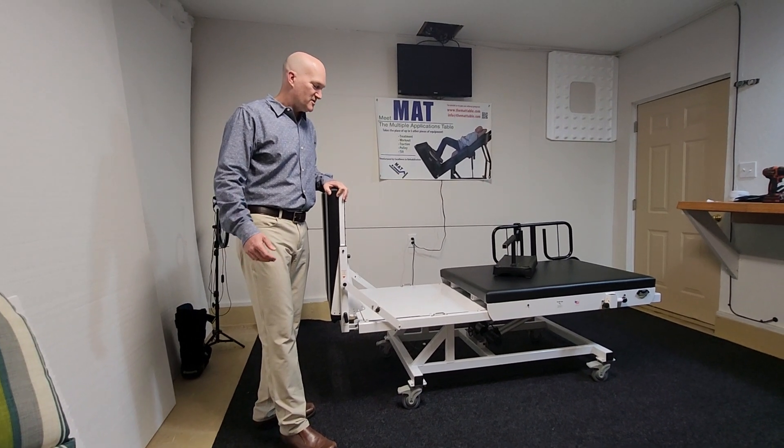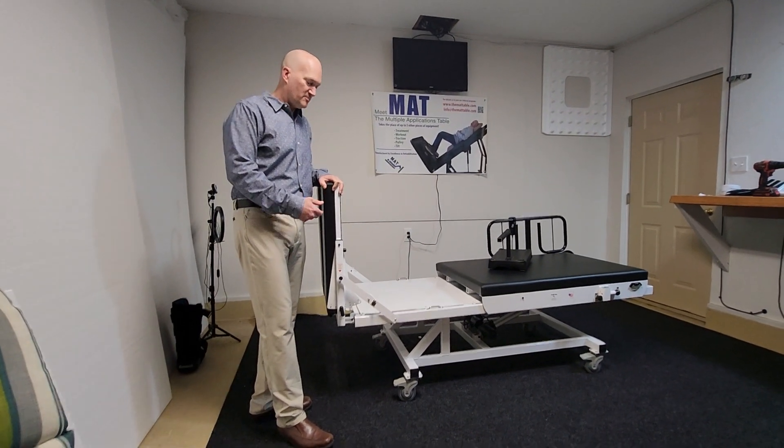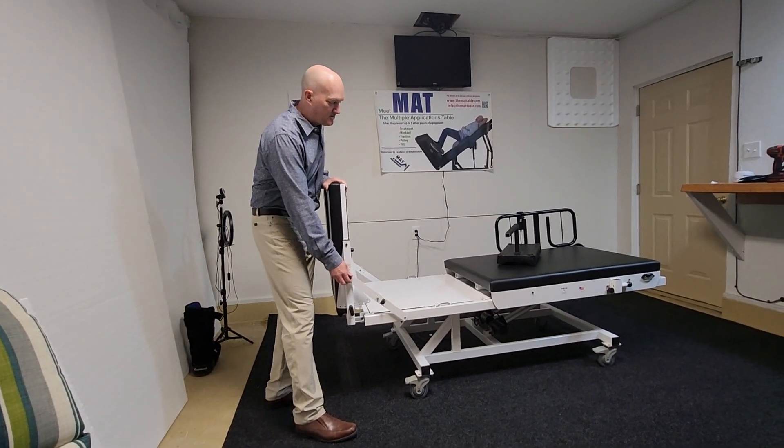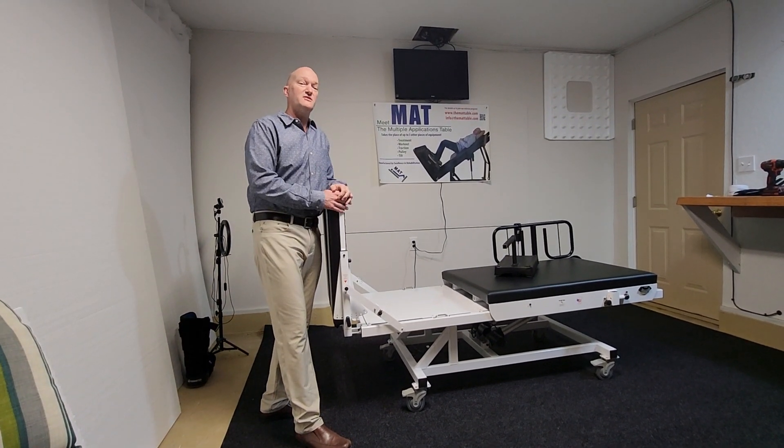Hello, welcome to this video of the MAT table — the multiple applications treatment table — in which we demonstrate how to convert the table to single leg squats.